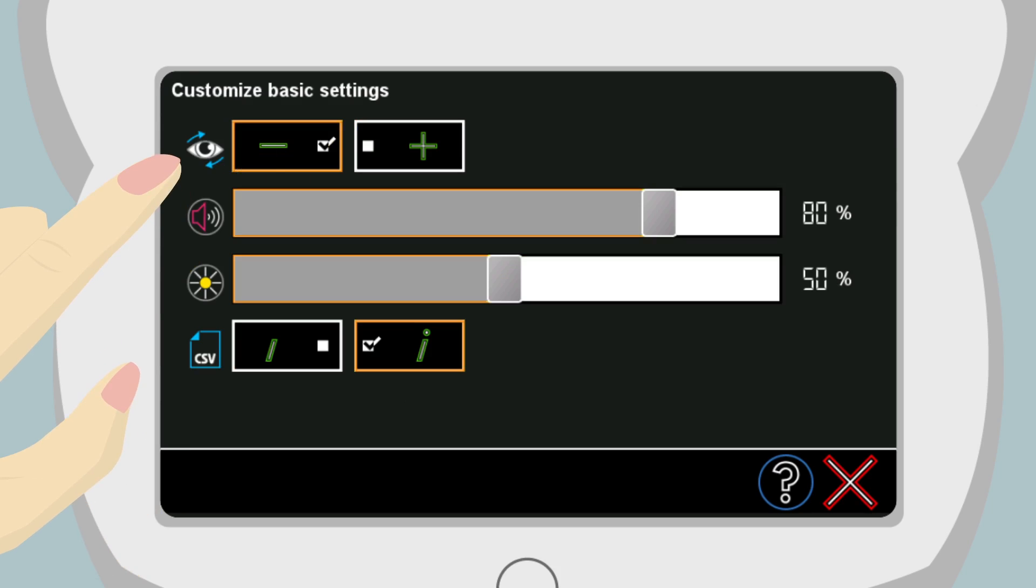The top line is the cylinder value. Usually this is left on the minus sign. Next is the volume of the warble sound, followed by the brightness of the screen adjustment. The last selection is the separator for data import and export.